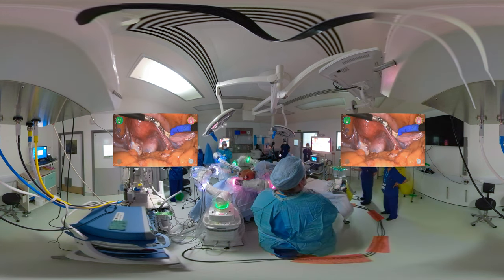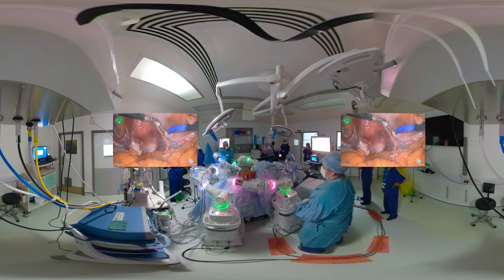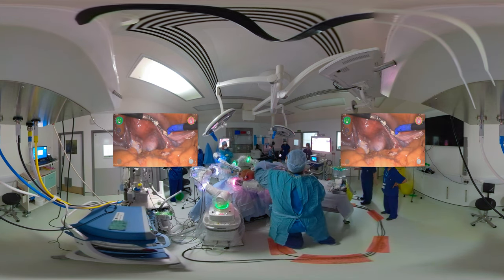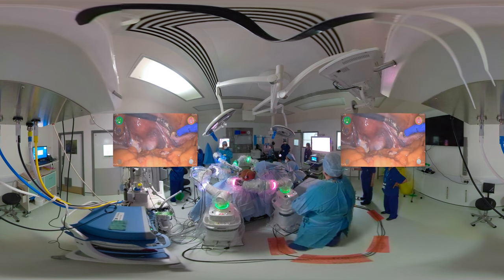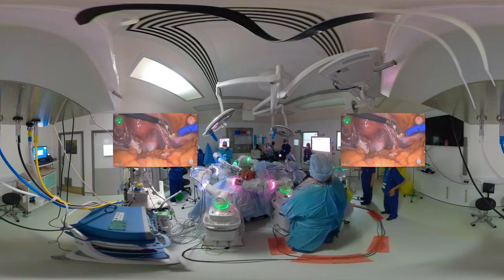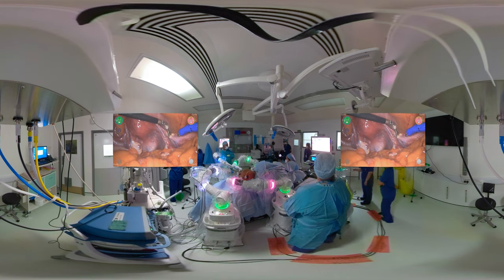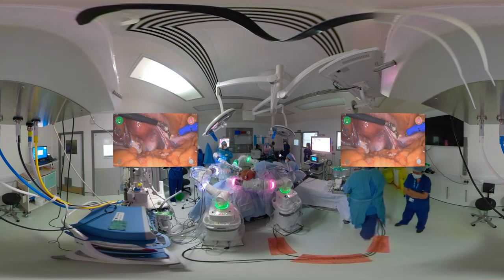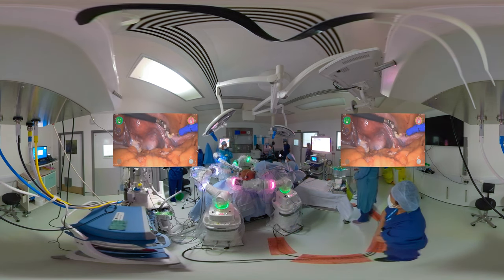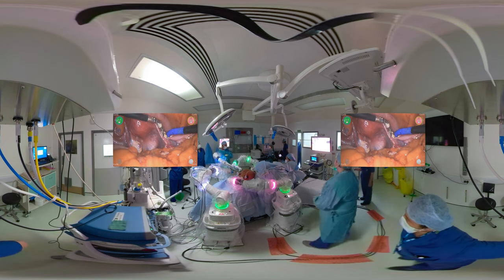The diathermy settings here are 20, 20, and 10 for coagulation and cutting. Here we can also see the theatre setup — the instrument arms at work being controlled by the surgeon at the console at the far end, with the arms and setup around the patient. The scrub nurse is here at the end, and we have all three screens: one on the foot end of the patient and one on the left hand side, so that they are visible by every member of the team.